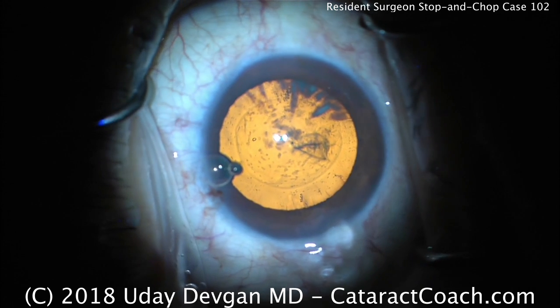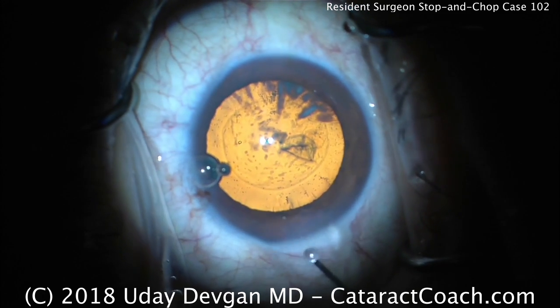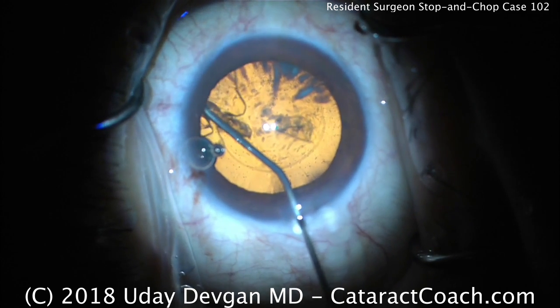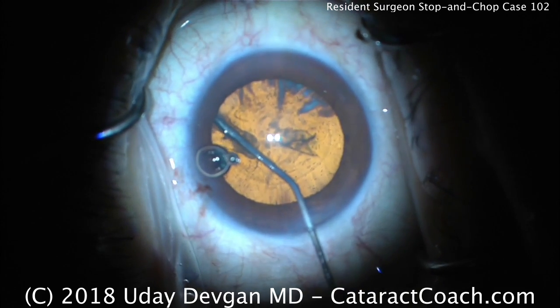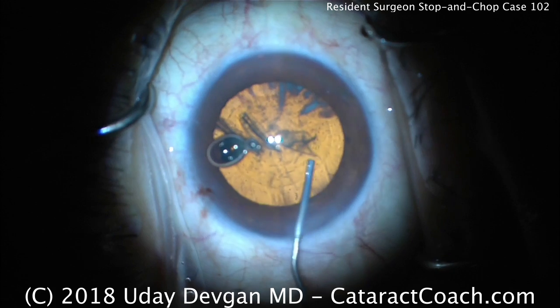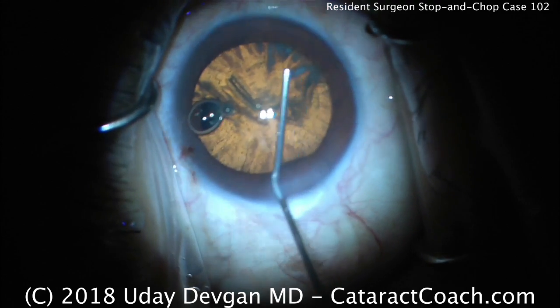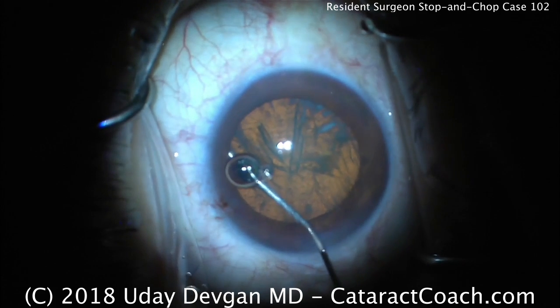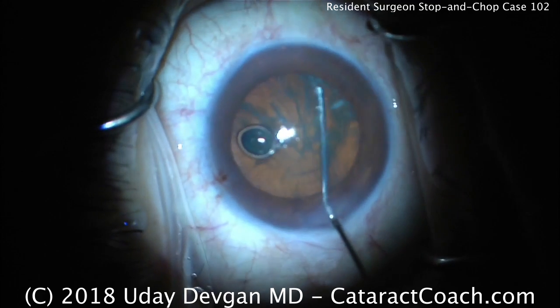Now it's time for hydrodissection. Watch the incision carefully because you'll see how much viscoelastic we're going to lose — that's normal for a cohesive. There's the cannula; good fluid wave coming across. Look at all that viscoelastic coming out of the eye. At this point there's almost no viscoelastic left, and the corneal endothelium is not very well protected. I encourage putting some dispersive viscoelastic to protect the endothelium prior to putting the phaco probe in the eye. Good hydrodissection with multiple waves — this should rotate quite easily. Look at that.